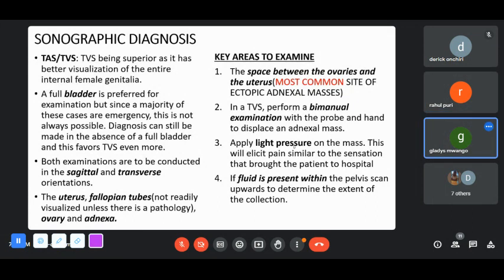Okay. But you realize also for Doppler, when you go to Doppler, it goes to a lower megahertz, so your penetration is better. Usually it's around 2.0 megahertz. Okay. So in future, those are some of the things that one can do. Okay, thank you, doc.